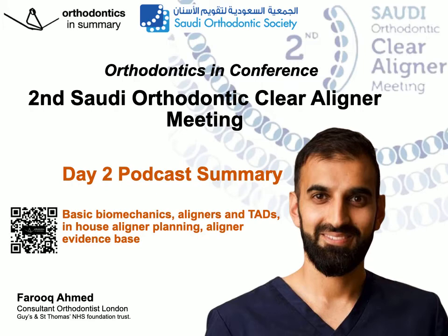But what was interesting, when they found this out, they also compared 1.2 degrees of activation versus 3 degrees of activation, and found it's far more predictable to have 1.2 degrees of activation. Now that is different to what we see with Invisalign, for example, where each aligner tends to have 2 degrees of rotational correction for premolars and canines.